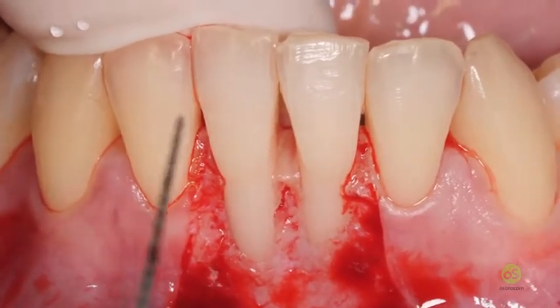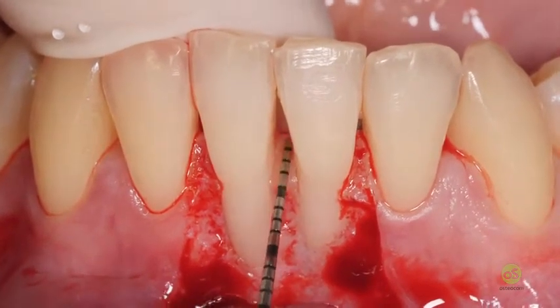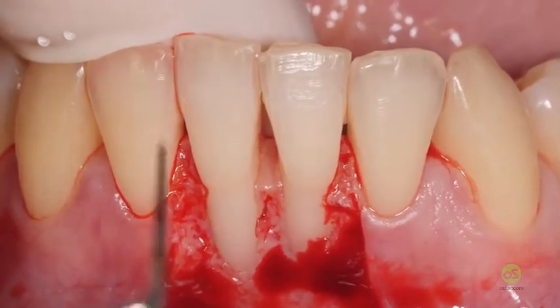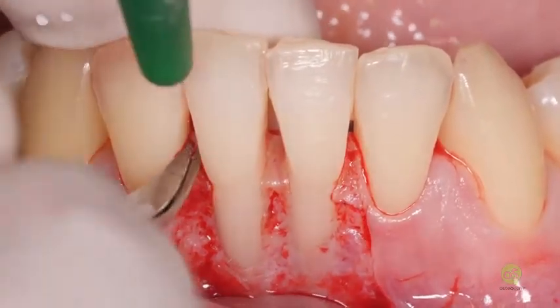You see, I provide about 3 millimeters of connective tissue bed horizontally together with the vertical component of this papilla, and this is thanks to the extension of the desepithelialization towards the lingual aspect.